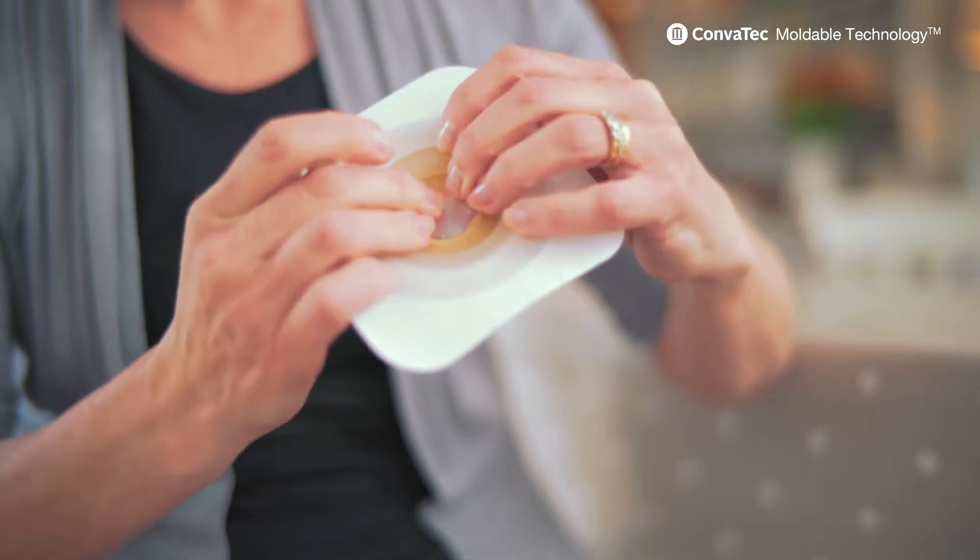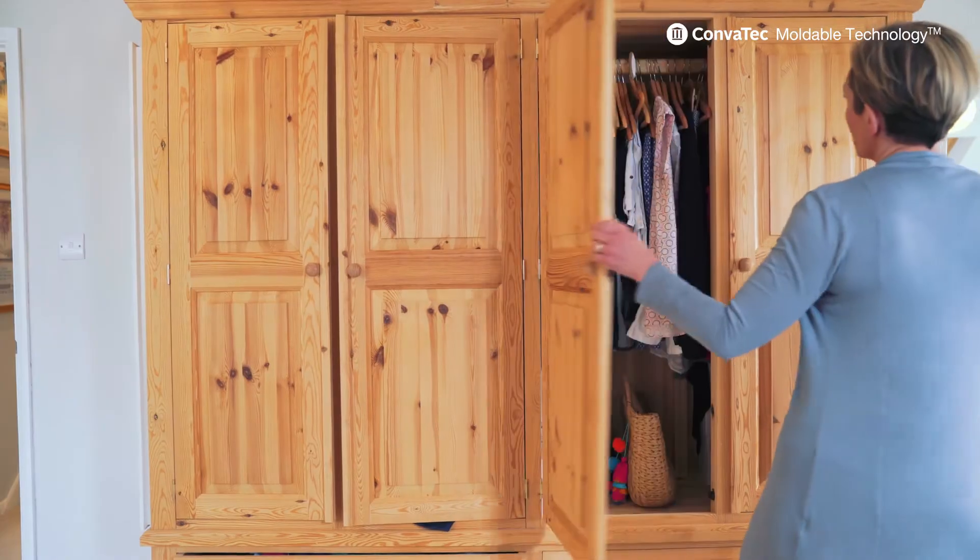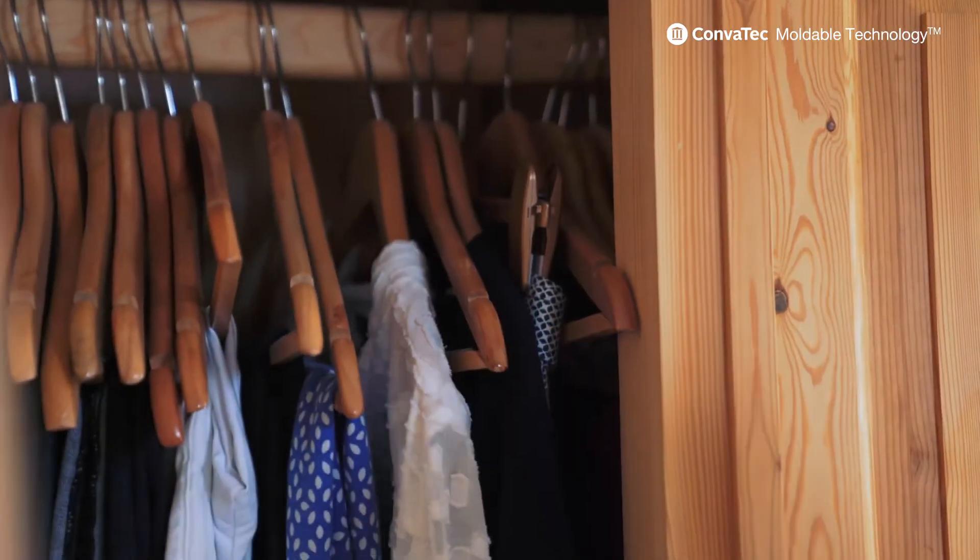I use the two-piece Esteem product. When you mould it, you sort of pull the edges back and it just fits perfectly and stays so much more secure. I don't have to worry about the size I've cut the bag — the fit is then perfect.